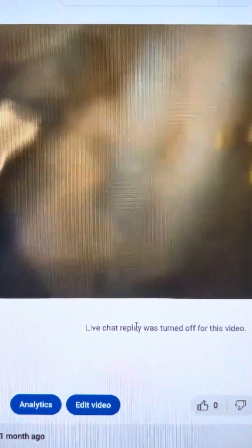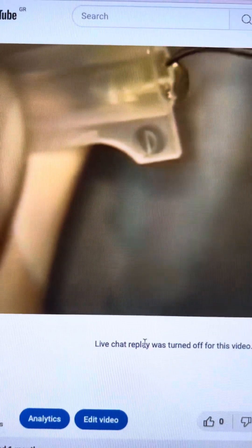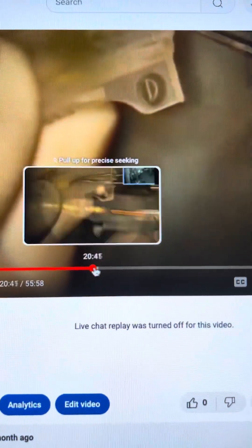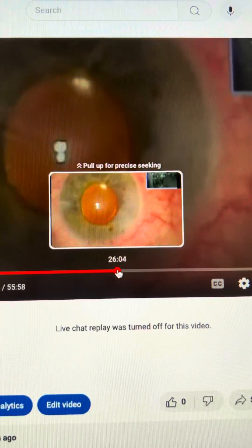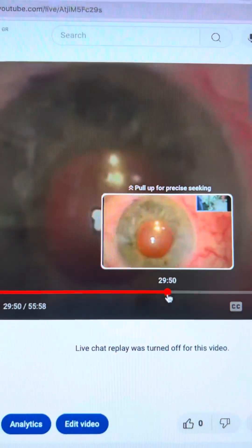So this is our toric lens and our go-to lens, the Alcon Clareon. We're going to implant the lens in a similar fashion as with any cataract procedure, then remove the viscoelastic very copiously and come in with our anterior chamber maintainer.